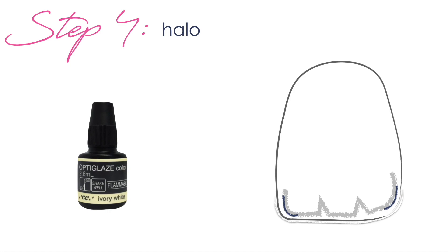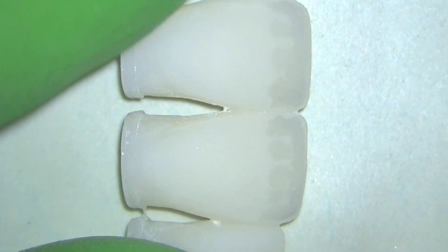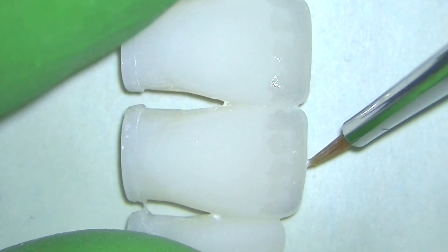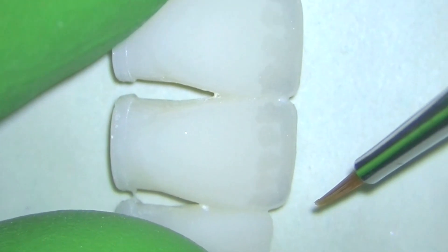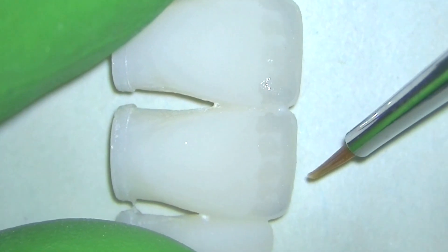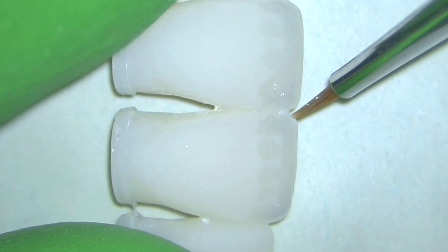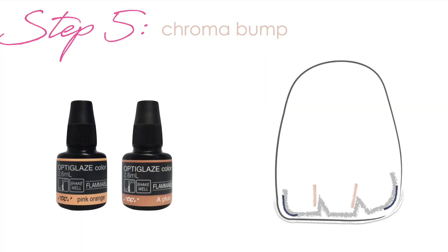The next thing I'm going to add is this ivory white, which can be used to add a halo that is a little bit more noticeable. I'm only going to do it on one of these centrals just to show you what it looks like. All I'm doing is taking that ivory white and dragging it right along the very incisal edge and just down the distal and mesial incisal corners just a little bit, and then I'm going to cure that. So at the end we'll see one tooth with a halo and one without.